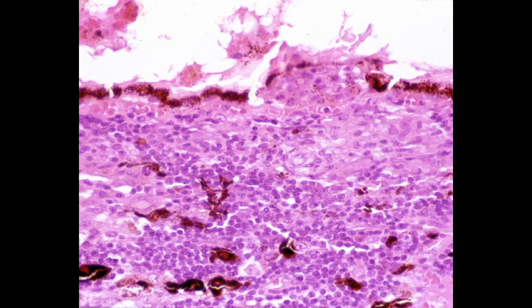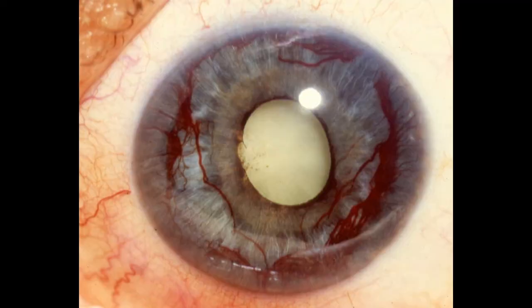Sympathetic uveitis is a bilateral granulomatous uveitis that typically occurs after trauma with incarceration of uveal tissue. Severely traumatized eyes that are hopelessly blind should be removed to protect the vision in the fellow eye. Many eyes that are enucleated have neovascular glaucoma.